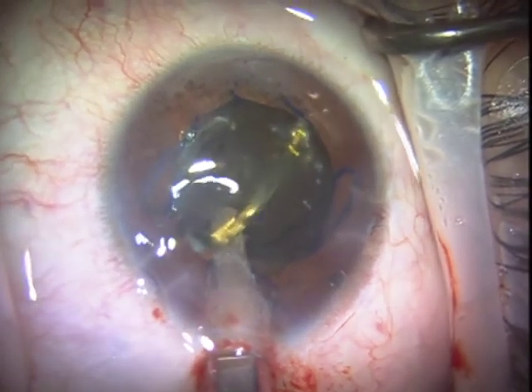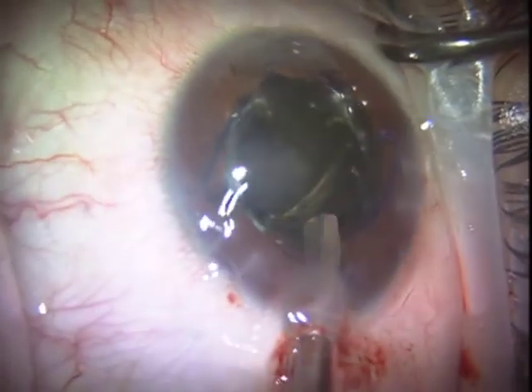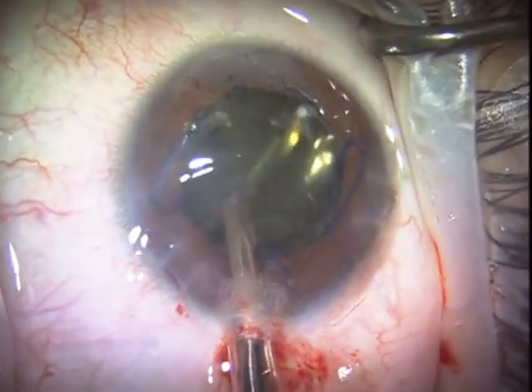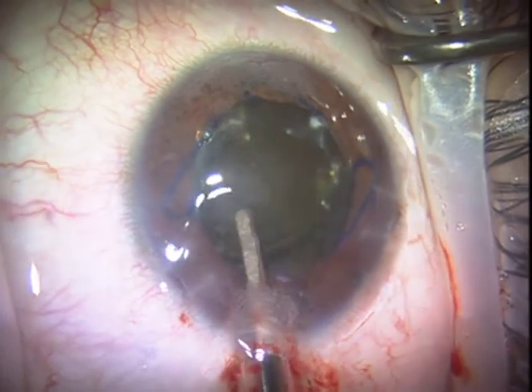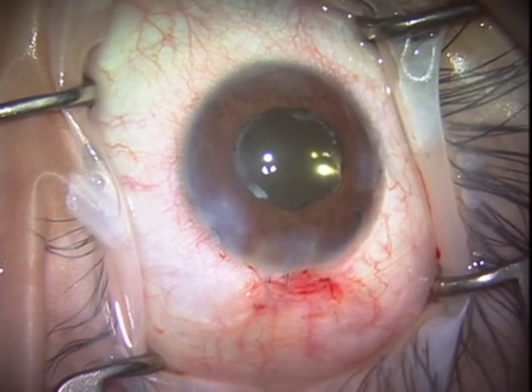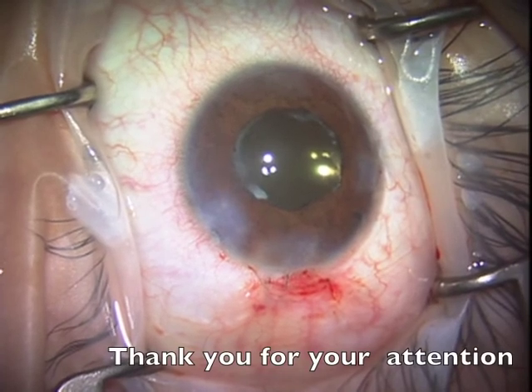This is sort of an extreme case of using tearing and cutting techniques for a fibrotic anterior capsule. Thank you for your attention.